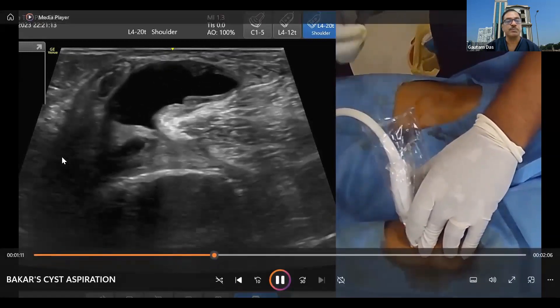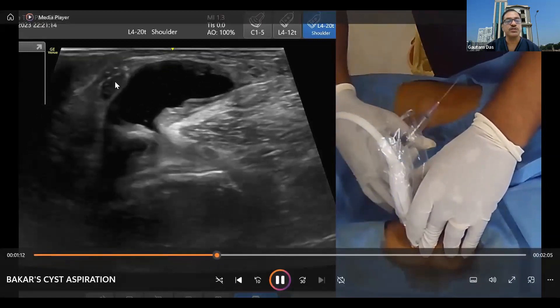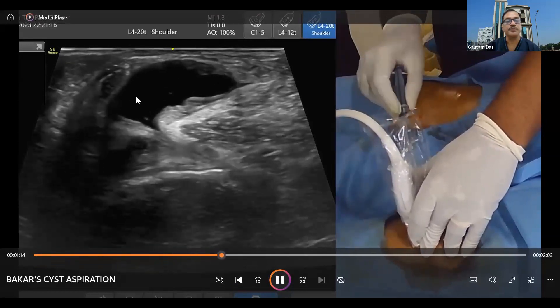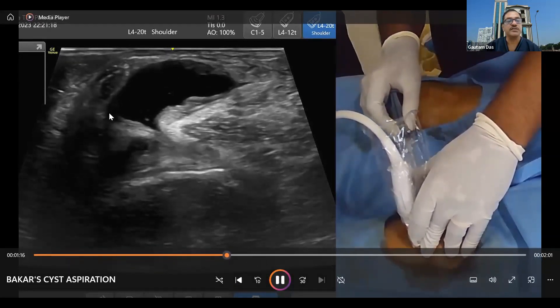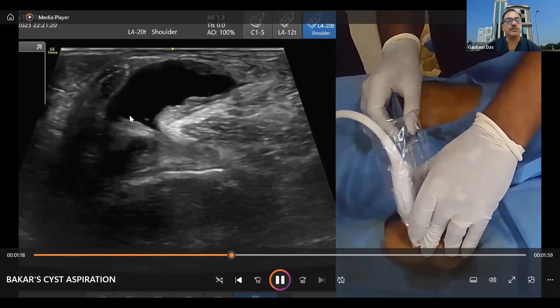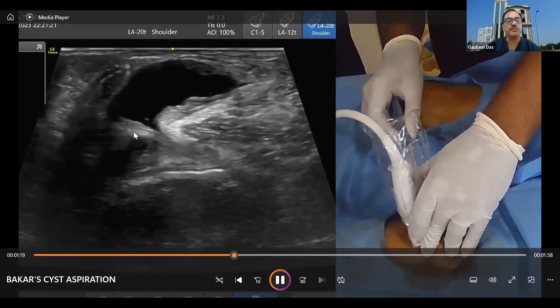So the semimembranosus is pushed here and this is the semitendinosus. We are giving a local anesthetic injection just below the semitendinosus.